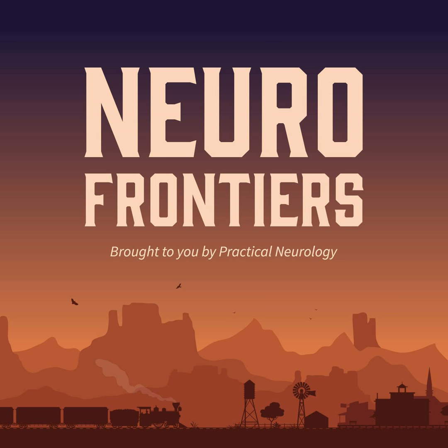The other main indication that I see commonly at my institution is when you have a cryptogenic stroke patient. So you've done the full workup, and you still don't know what has caused the stroke or the recurrent stroke. And then the question becomes whether or not you're just not seeing the vessel abnormality because the stenosis is so mild that it's not very obvious on lumen-based techniques such as CTA or MRI.